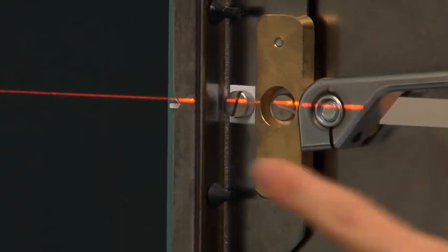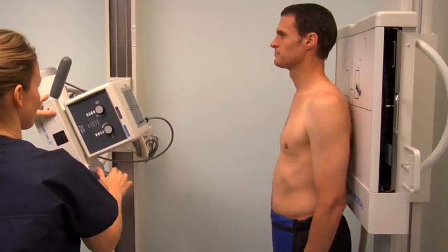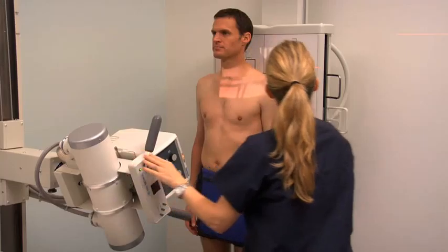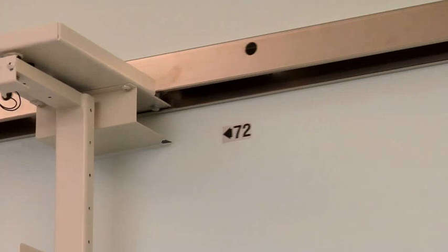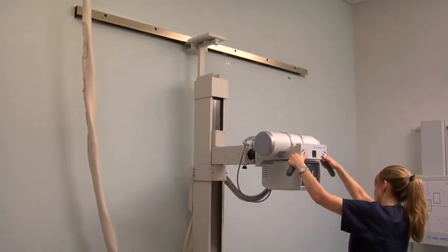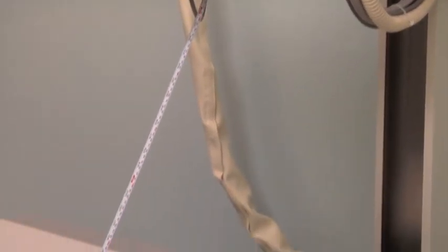The central ray is aligned perpendicular to the center of the image receptor. For certain projections or body parts, a specific angle may be required, so the central ray can be angled in a cephalad direction, meaning toward the head, or in a caudad direction, meaning toward the feet. The source-to-image receptor distance, or SID, is the distance from the X-ray tube to the image receptor. The SID is the first controlling factor for distortion, as the greater the SID, the less the magnification.